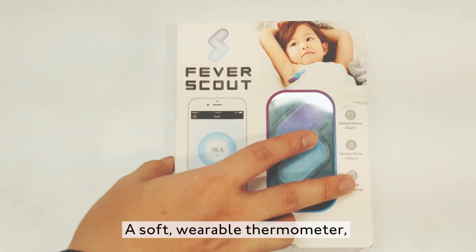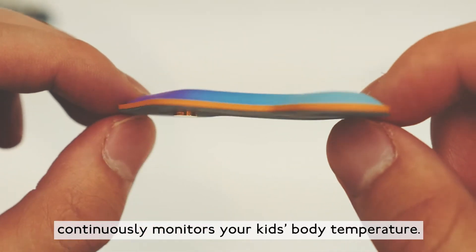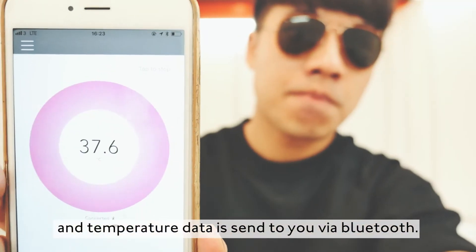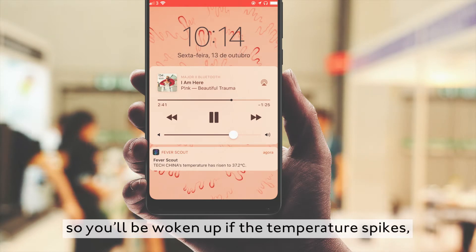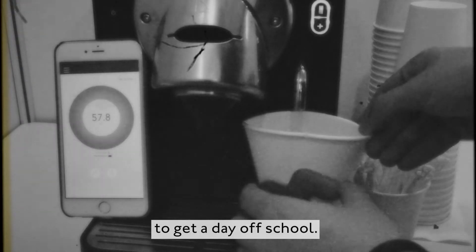A soft wearable thermometer continuously monitors your kid's body temperature. Stick it in your child's armpit and temperature data is sent to you via Bluetooth. Turn on the alert so you'll be woken up if the temperature spikes — or if your kid stuck the patch on a cup of coffee to get a day off school.